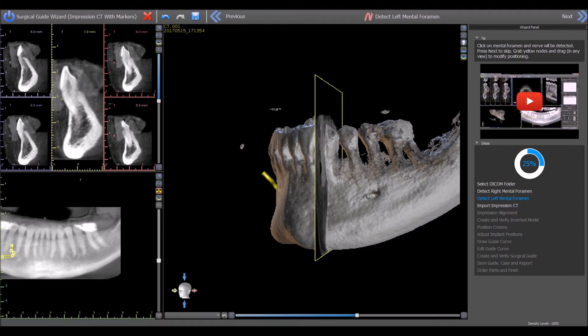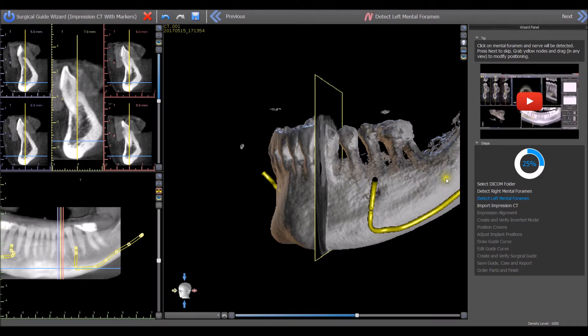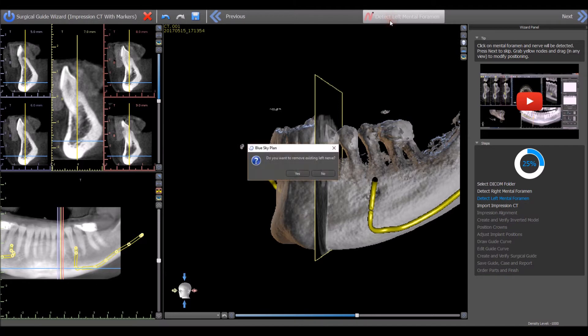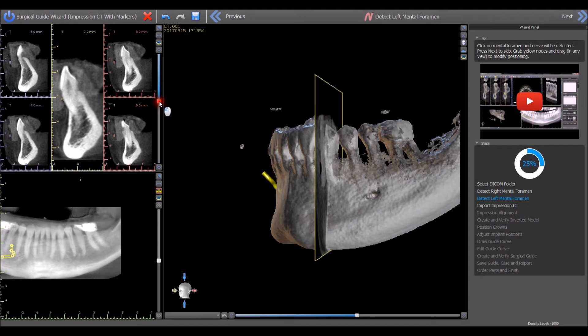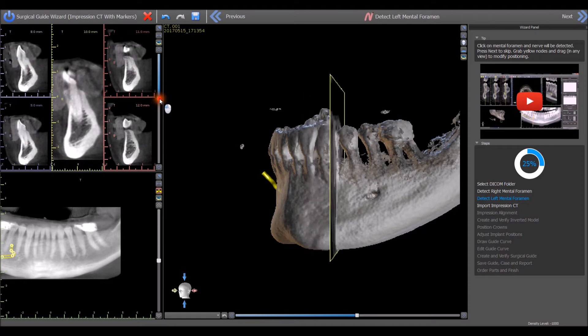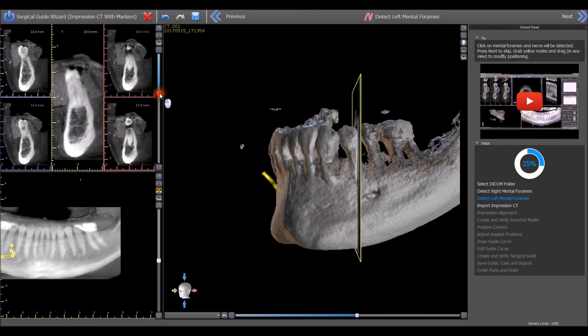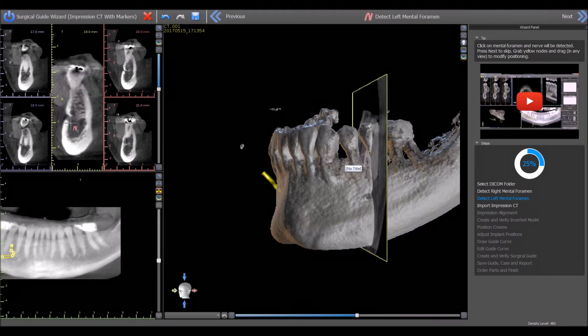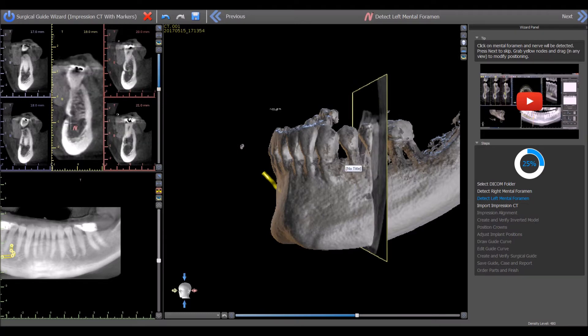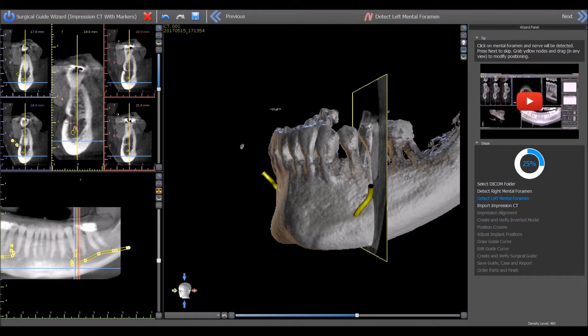Left-click once on the entrance of the left mental nerve to have the left nerve drawn automatically. If it is necessary to redo a step, click the step name found at the top middle of the screen. The nerve can also be detected by using the slider next to the top left view to move through the slices and locate the slice that shows the entrance to the nerve. Left-click the entrance to the nerve for the nerve to be detected automatically. Press the Next button.